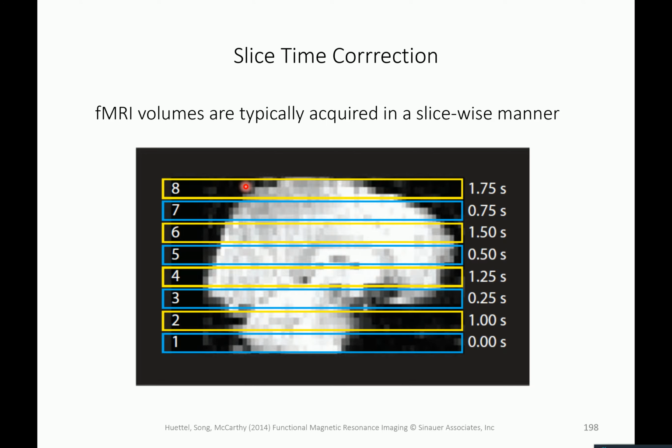So if there was slice time correction, that meant people acquired the data in slices, so they did 2D imaging, because most people do 2D imaging. What that means is that you acquire the data slice by slice. This seems to be reinterpolated, because you can see that for each slice you have kind of 3 voxels here, but of course this is something that actually happens.